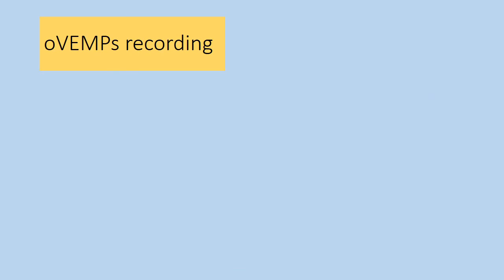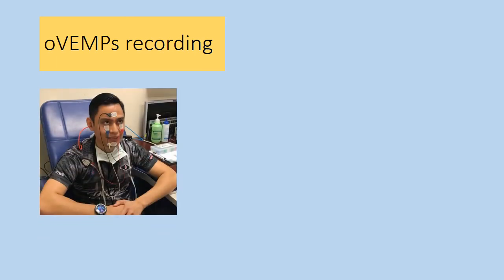For OVEMP recording, instruct the subject to look upward at midline and maintain the gaze throughout the recording, which takes less than half a minute. The subject's gaze can be controlled by instructing them to fixate on a particular target. You may use a sticker that is stuck on the wall or ceiling. As you can see here, Mr. Taufik is looking upwards to the sticker stuck on the wall.